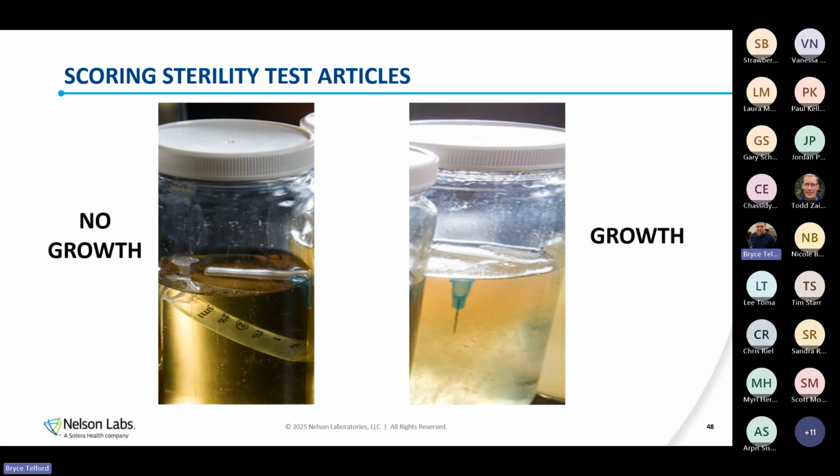There's no additional guidance in the standard, and as such, there's really no industry approach on how to do that risk assessment. Nobody's really willing to say, well, I have a 50% recovery efficiency, and that's okay for my test of sterility, my sterility passed, and therefore my product's sterile. Nobody has really been willing to put that forward at this point on what a risk assessment or what even the additional testing would look like.